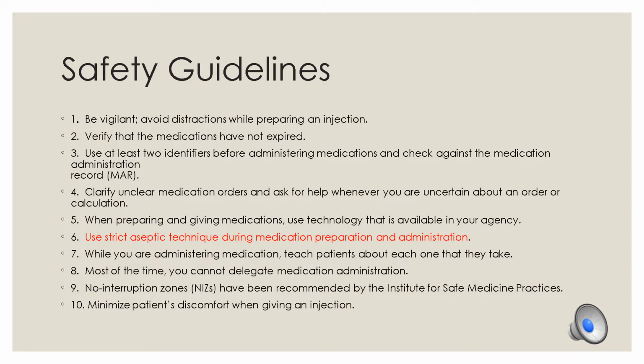So you always need to clean with, at the hospital they don't have alcohol pads, they're like alcohol pads, I can't remember the name, but you'll use those before and after administration. If those medication prep pads aren't available, you will use alcohol. You want to educate your patient. You cannot delegate IV bolus medications. You can delegate IV piggyback medications. And you want to minimize patient discomfort when giving medications.